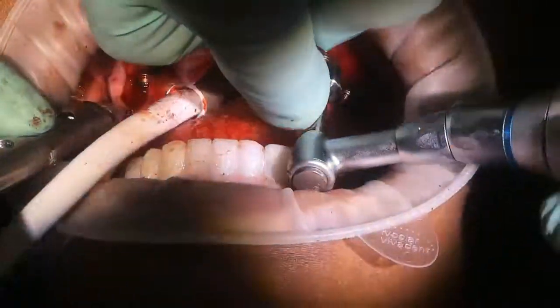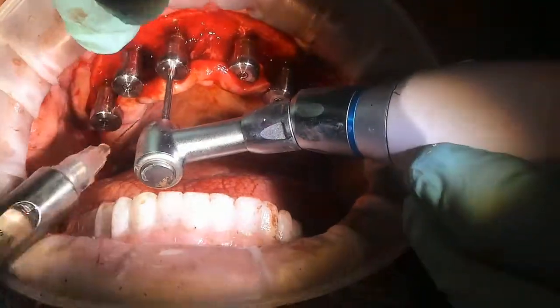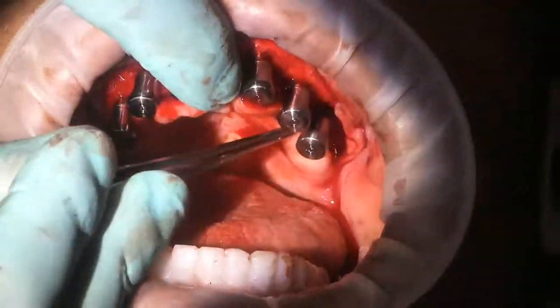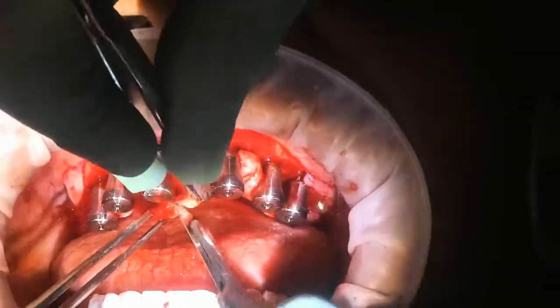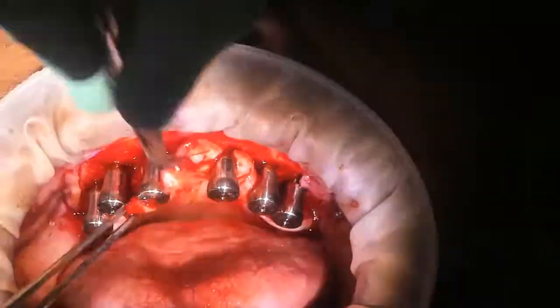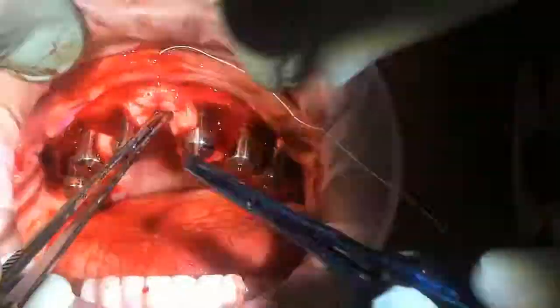Then the rapid appliance is removed along with the block-out gaskets and carrier guide, and the fixation base is also removed. If the doctor chooses, comfort caps are placed and the patient is sutured. Then we move on to the opposing arch.